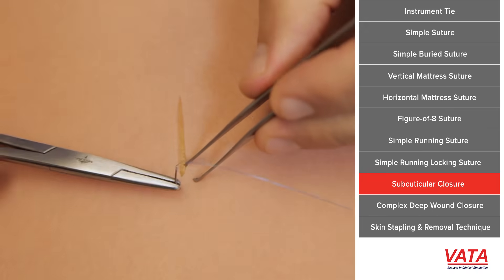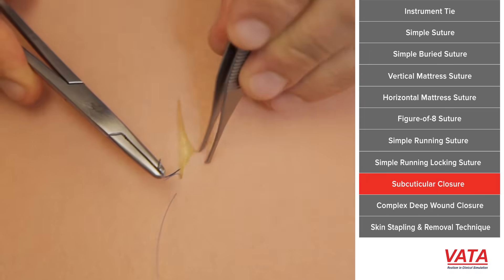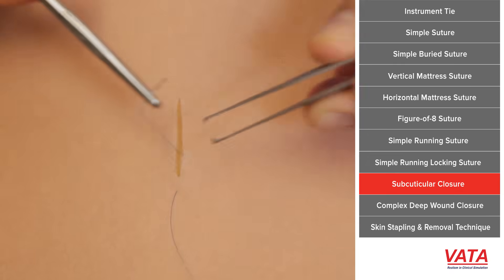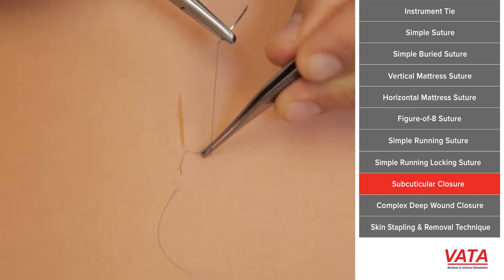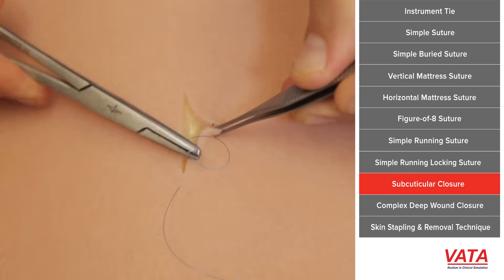What we're going to do is run a stitch under the skin. This can be done either with permanent suture or absorbable suture — I'll demonstrate here with permanent suture. I'll enter from outside, entering just at the level of the deep dermis. The key now is to take horizontal bites in that deep dermis, exactly the same on both sides, and advance as you go.